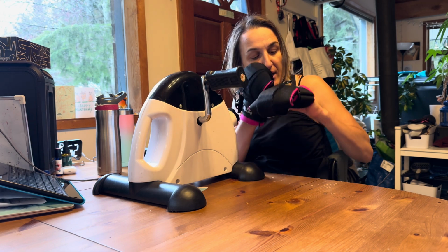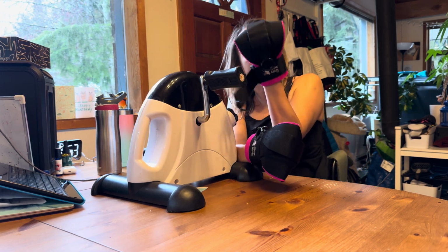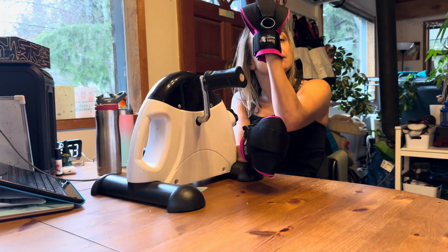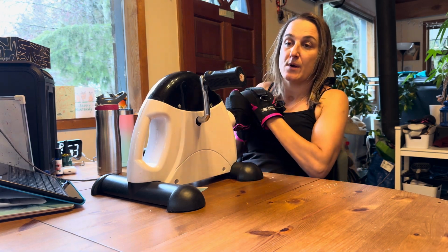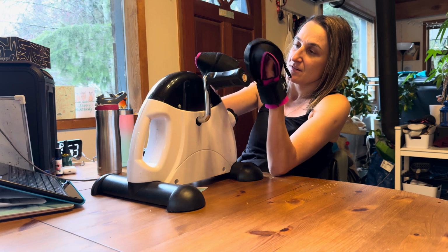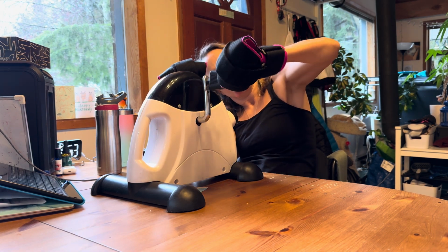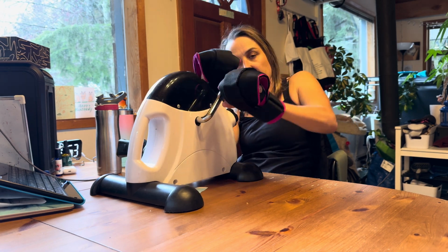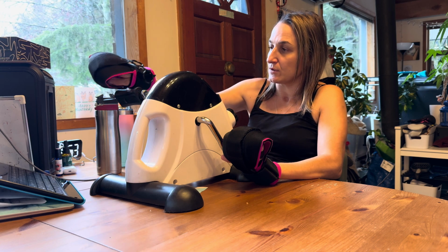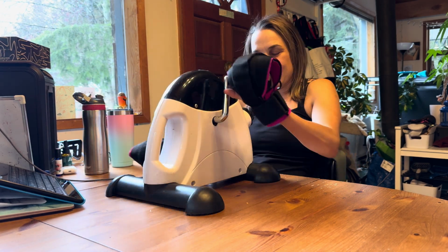And then same thing on the other side, I'll put this around my wrist. Open it up. Then twist it around, and then putting this in. So actually bringing the thumb out. And then with the thumb going in where the handle is and fitting it in. So it's gonna be a little bit loose. Then bringing the other one up. And again, bringing the thumb out. And there we go. And now I'm ready to go for a spin.